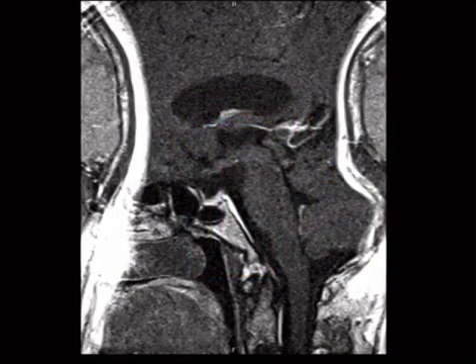Alright, so here's the first one. What we've got here is taken from a pituitary protocol MRI. It's a narrow field of view, and it looks like we've got part of the head wrapping around on the other side. So this is called aliasing. It's an error of undersampling. Basically what happens is you get wrapping of the anatomy from the undersampled portions.